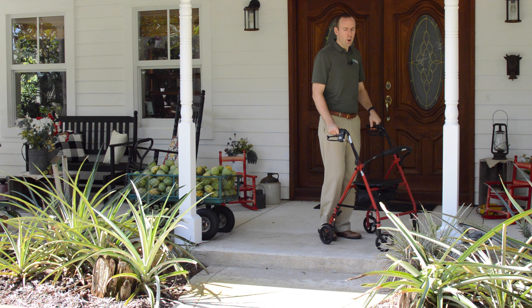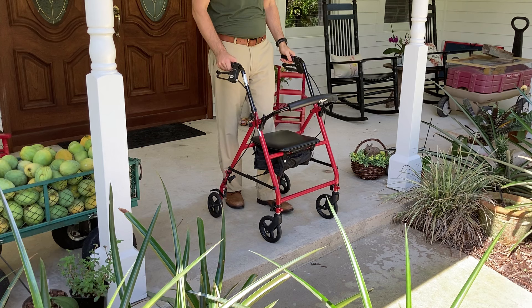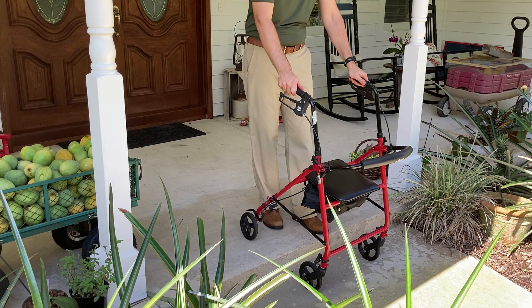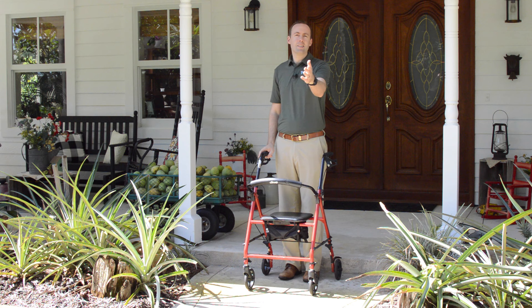Now when you're coming down, what you want to do is make sure it doesn't take off on you. So again, you're going to come up as close as you can to the edge, just get those front two wheels down on the ground first. You can squeeze the brakes so it doesn't go taking off on you, and then just walk it forward a little bit so that those back wheels go down, and then once it's on the ground you squeeze the brakes, step down slowly, and the step is conquered safely — no falls.